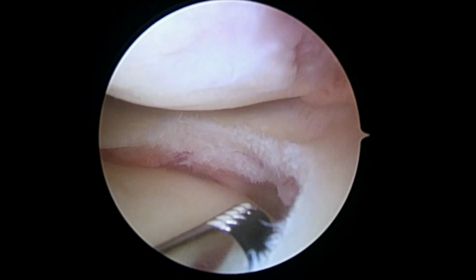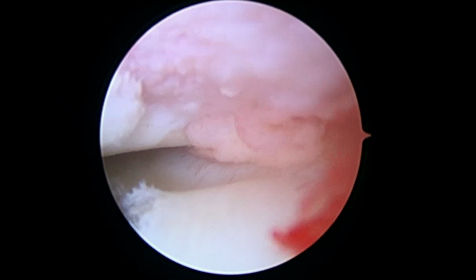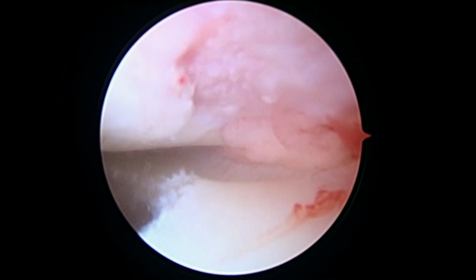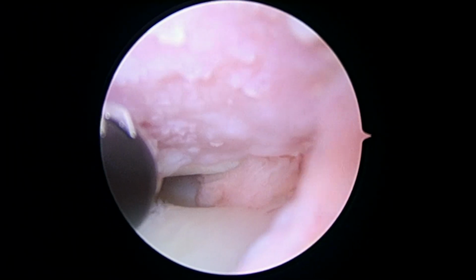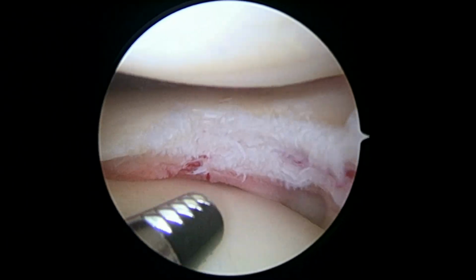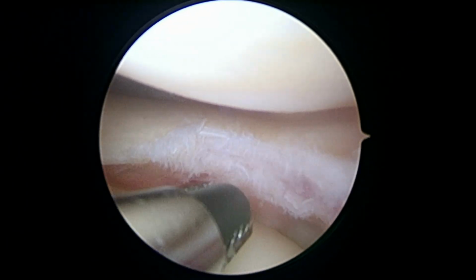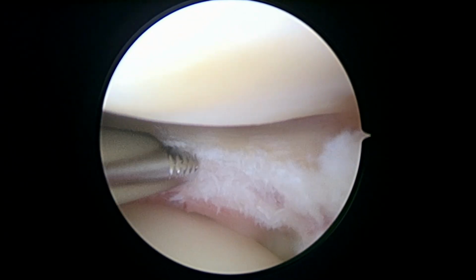As far as the condylar defect, that's going to be right up here, and that's what we're going to look at next. But we can see there that that's where we're thinking about putting in that plug. The normal cartilage over here is nice and smooth, but over here on this lateral side, you've got this area where you've lost all the cartilage. So before we make any decisions there, we're going to look around the rest of the knee, particularly in the gutters and in the suprapatellar pouch, to make sure there's no loose bodies.